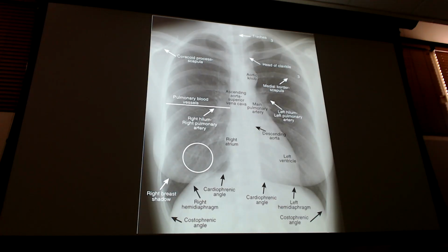All right. Here is another X-ray with more labels for you. Okay? The white, the grayish lines are your vasculature. Bronchi are invisible, they run parallel with the vasculature. Okay? What I'm circling here is all the vasculature in there.